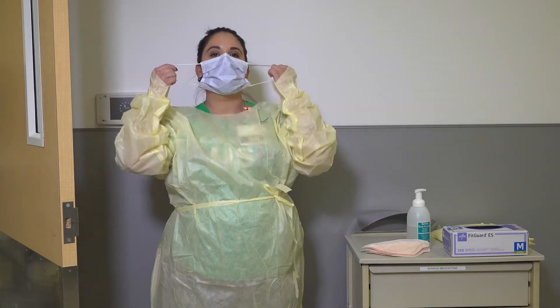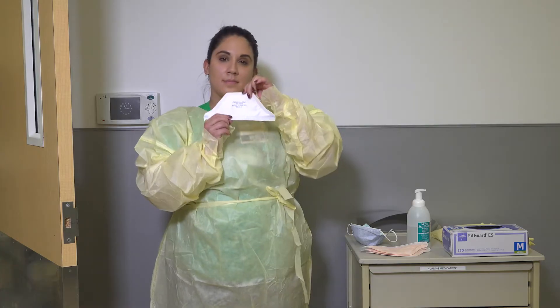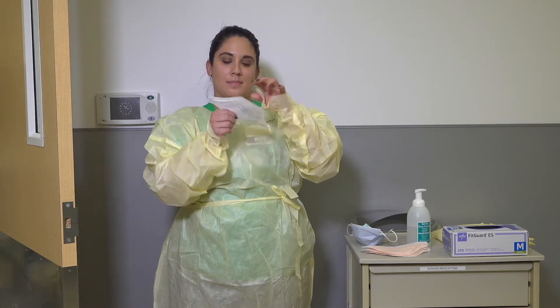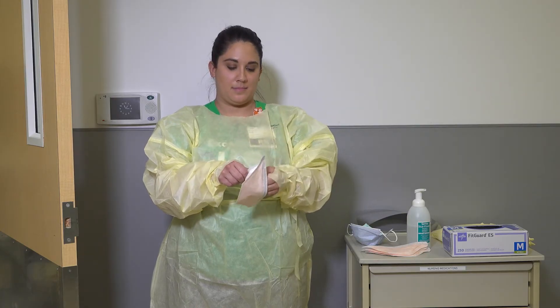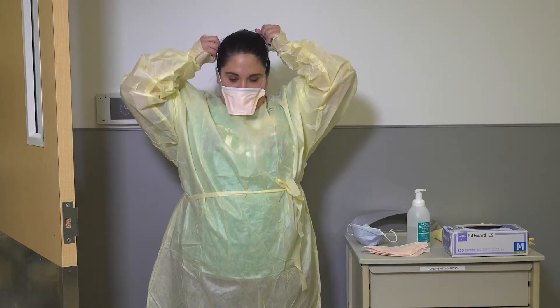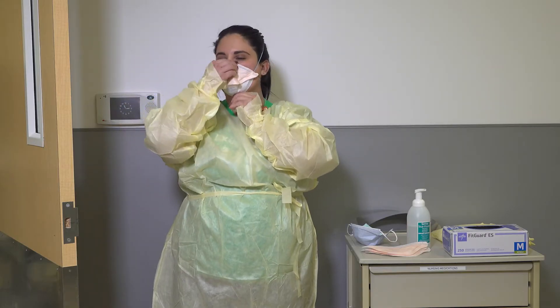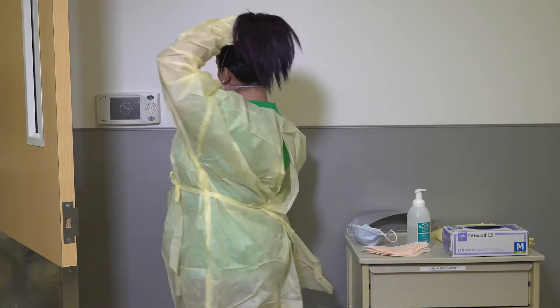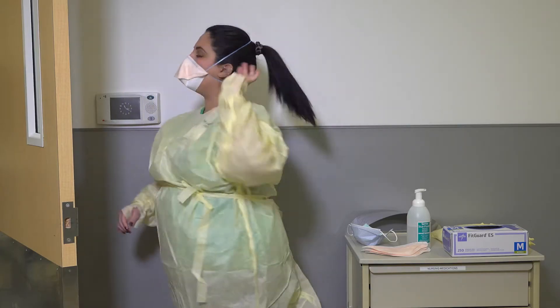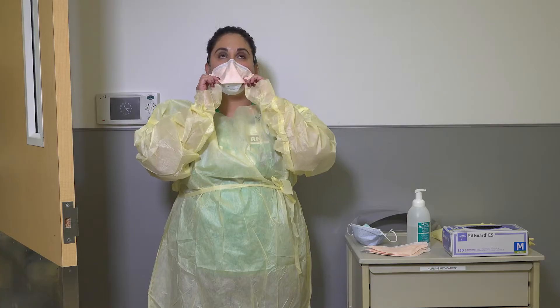If you are currently wearing a regular surgical mask, remove the old mask before donning your N95 respirator. Ensure that you have the correct size N95 respirator by checking the label on the back of the mask. Place the respirator over the nose and mouth, ensuring that the elastic ties are at the crown of the head and the nape of the neck, and that the flexible band fits snugly at the bridge of the nose. Blow into the mask to check for proper fit — you should not feel any air escaping from the mask.